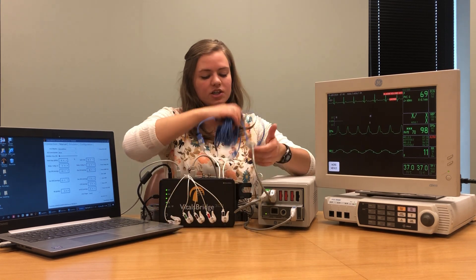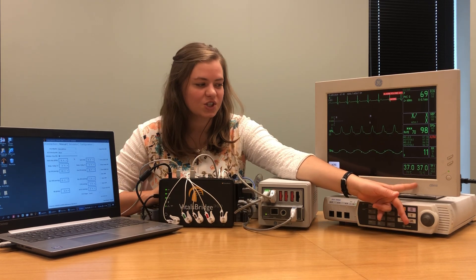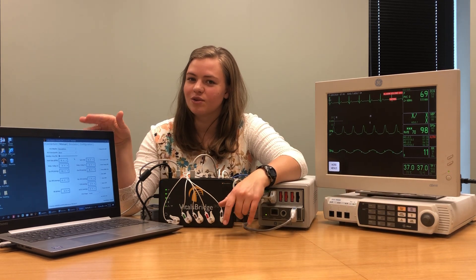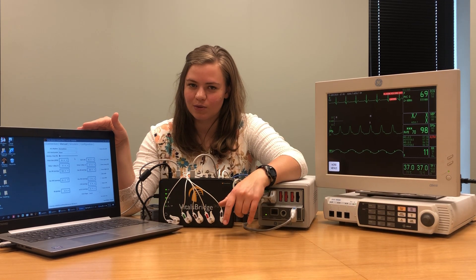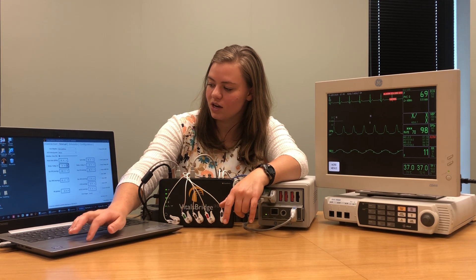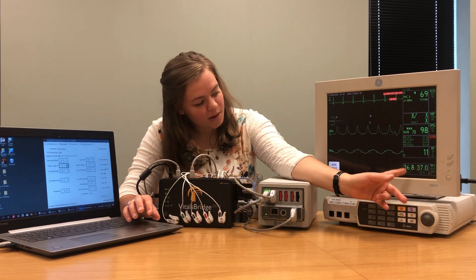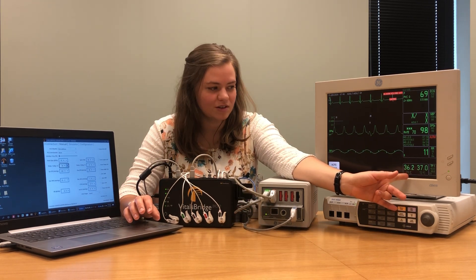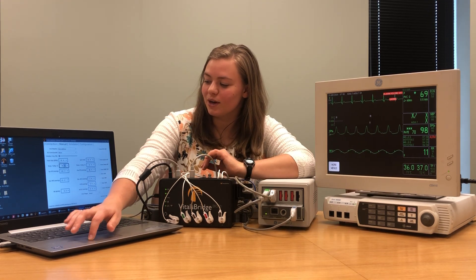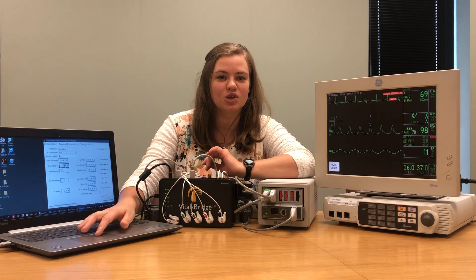Once you have those connections made you should see two temperatures appear on the bottom of your GE screen, and those two temperatures should match what you have in your VitalsBridge connector software. Just to make sure everything is working well, I'm going to drop temperature one down to 36 degrees — and you'll notice that temperature one on the monitor also drops to 36 degrees, which is exactly what we would expect. I'm going to bring it back up, and you can perform a similar test on temperature two.